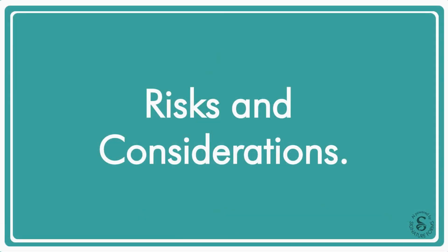Next, I want to review the most important risks. As with any surgery, there are risks you should understand before moving forward. These can include bleeding, infection, fluid buildup, scarring, swelling, pain, delayed healing, asymmetry, changes in nipple or skin sensation, and the chance that the breasts may not heal with the exact shape or balance you were hoping for. Because this procedure involves implants, there are also implant-related concerns such as rupture, wear over time, rippling, shifting, firmness caused by recurring scar tissue, visible contour changes, or the need for a revision later on.